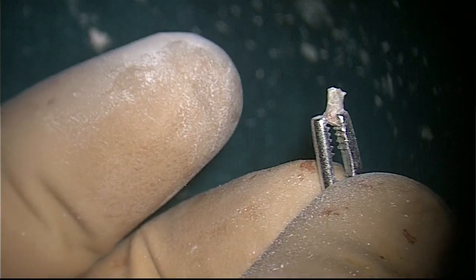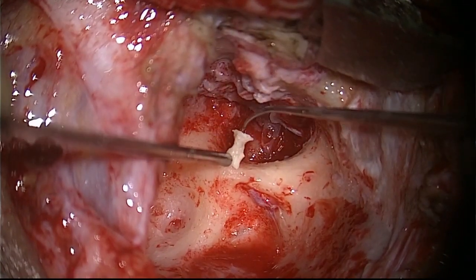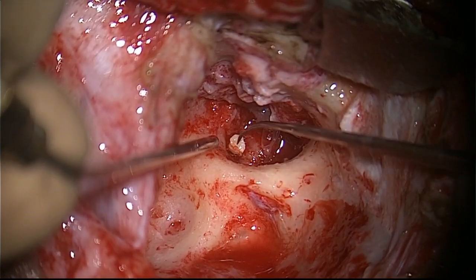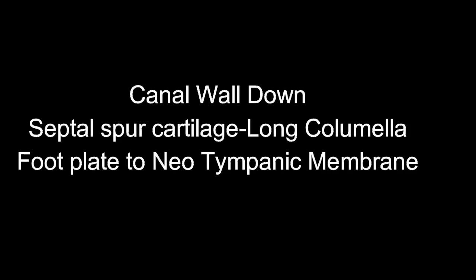All this ossiculoplasty, whatever material you use, it has to be held by a Derlacki ossicular holding forceps. And now you can see the boot shaped lower part is going to sit on the mobile stapes like that. So before we keep anything on the footplate, we have to keep a small piece of fascia.